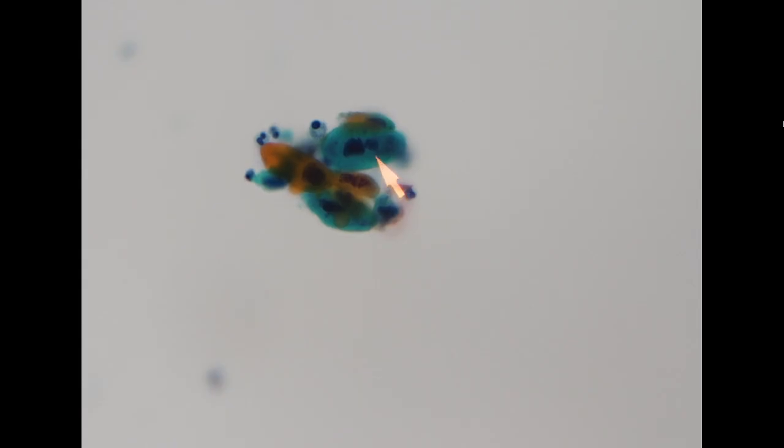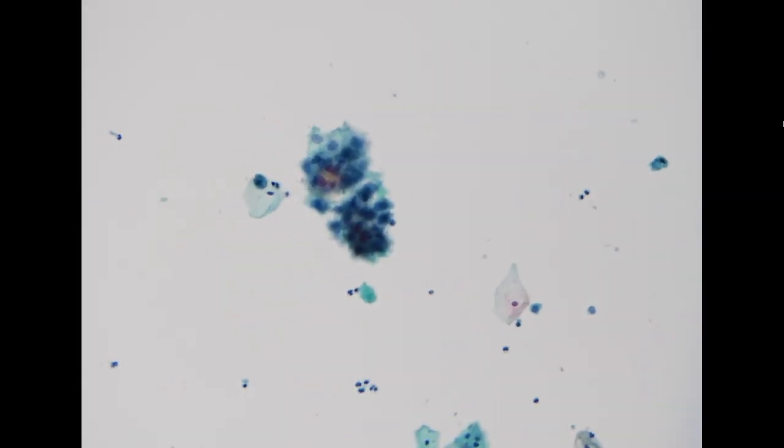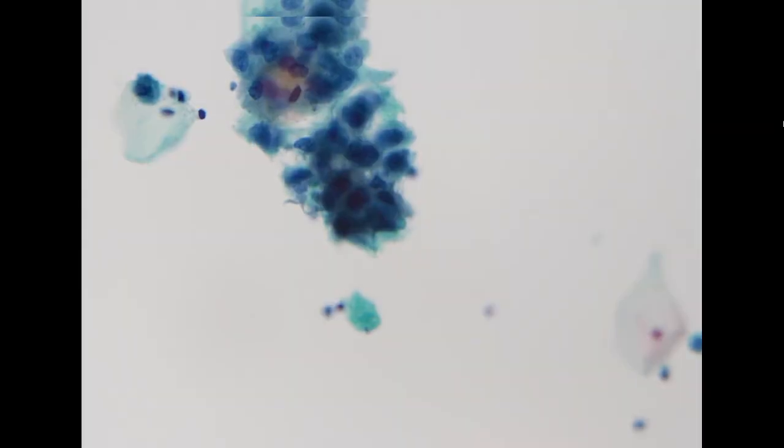So stone atypia can cause hyperchromasia, increased NC ratio, as well as some squamous metaplasia. However, if in the chromatin pattern you don't see coarse chromatin, so here it's more like a smudged chromatin, and the NC ratio is not exceeding 0.5, and you have a very definite clinical history that the patient has a stone, you don't need to call this atypical.